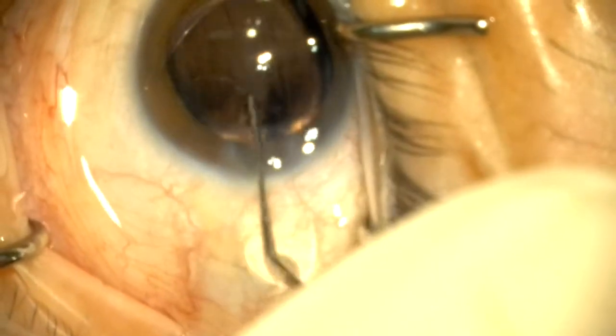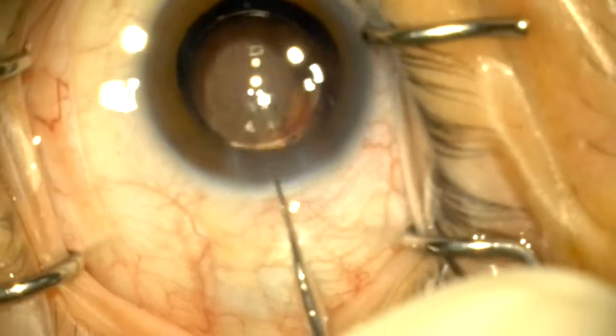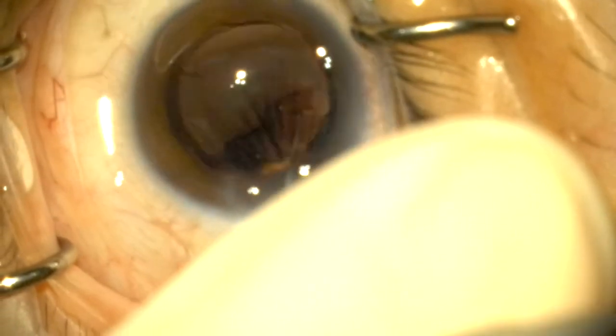However, there is no marking shown on this video as the surgeon is using a digital marker. The capsular bag felt stable. However, we still need to take care not to overstretch the capsular bag. We also need to make sure that there is no vitreous in the anterior chamber during this maneuver.